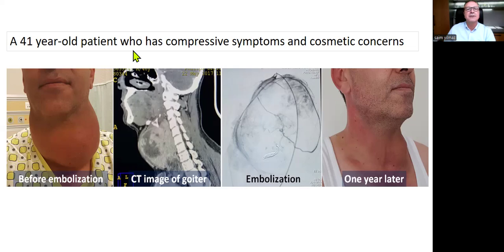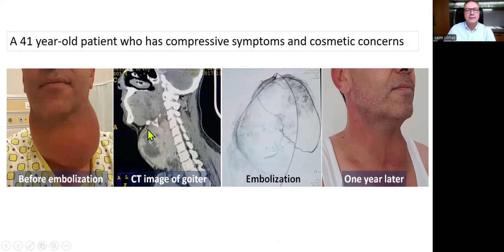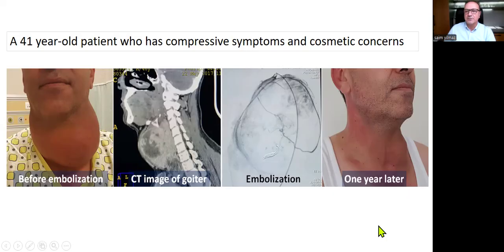This is a 41-year-old patient who has compressive symptoms and cosmetic concerns. This is before the embolization — he had a large goiter, and this is a CT image of the goiter before the embolization. One year later, you can see a marked difference between the before and after images.